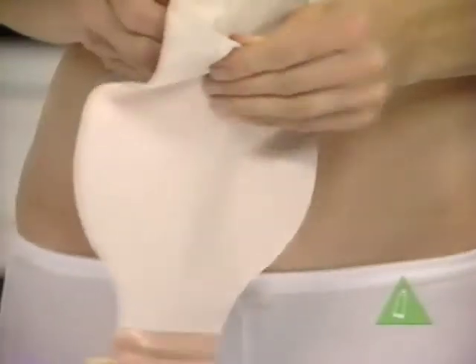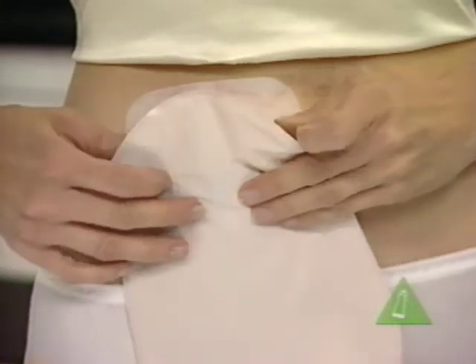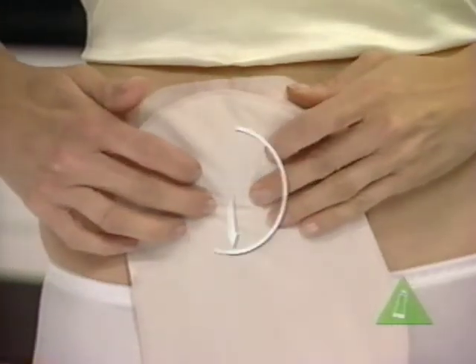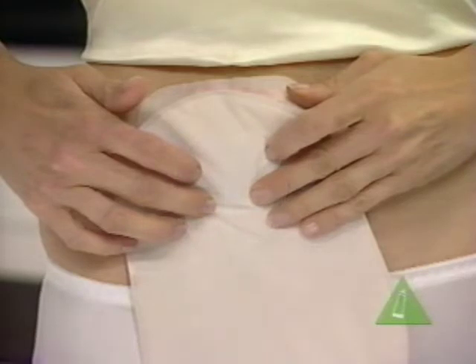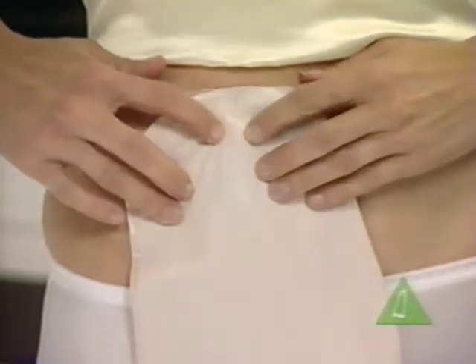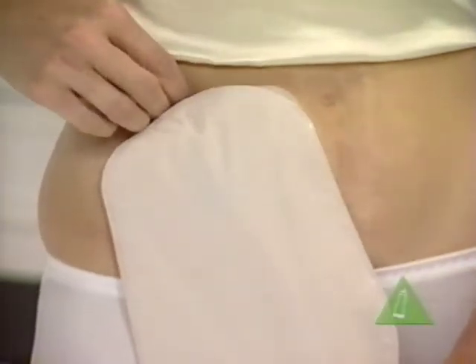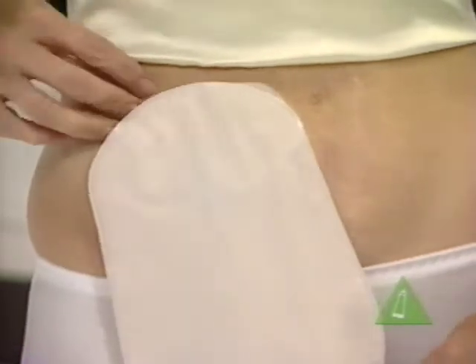Now we come to the final step, applying the SureFit Nutura pouch flange to the wafer flange. Make sure the pouch has a small amount of air in it. Line up the outer lip of the pouch flange over the lip of the wafer flange at the 6 o'clock position. Using gentle pressure, continue moving your fingers around to the 12 o'clock position. You will hear a series of clicks as you do this. Give a gentle downward tug to make sure it's locked into place.